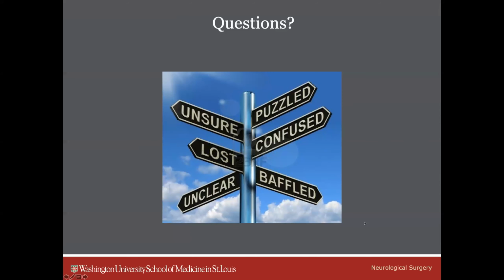I know for most of us, and I see it in trauma, I see it in the ICU, it's kind of this black box that we're always just trying to get a better understanding of why things are done the way they are. I think there were 2 points that you hit home, or the 2 issues that I often hear. One is who gets the bolt, and you kind of address that. One that goes with that is bolt versus EVD, and you explained definitely why EVD is more accurate, but has its risks.